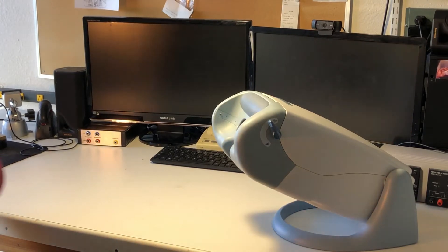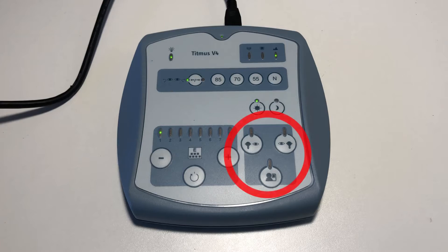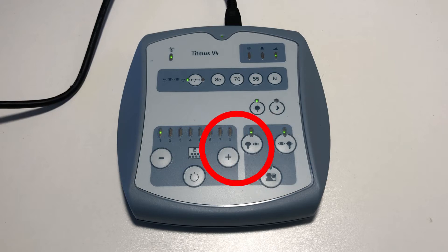Have the patient look into the vision screener. You will know they are in the correct position when the lights on the bottom right of the control panel light up. Note the light on the left indicating that the vision screener is displaying slide number one.